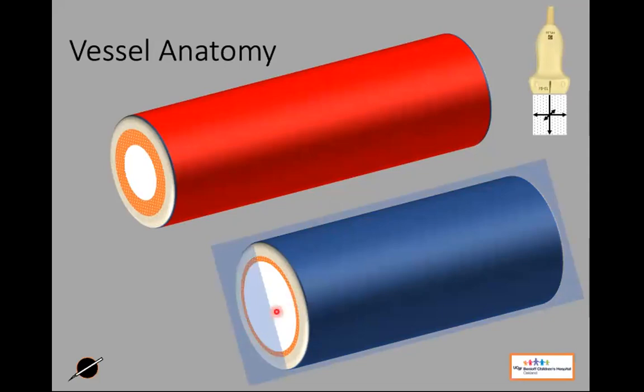We're going to be splitting the vein down the middle, and we're going to see the top wall of our blood vessel and the lower wall of our blood vessel. And then we're also going to take a cross-sectional slice through that blood vessel as well. So be thinking about this when we talk about orientation, like a cross-sectional view and our longitudinal view.